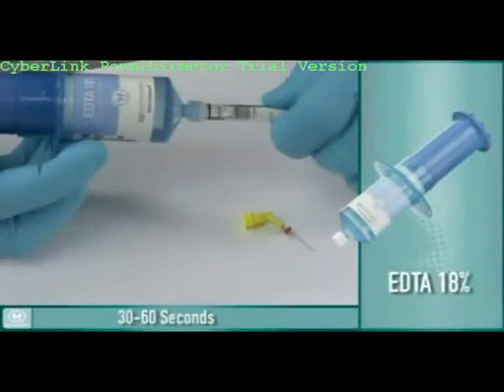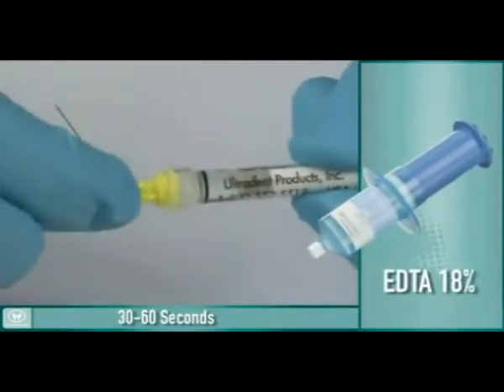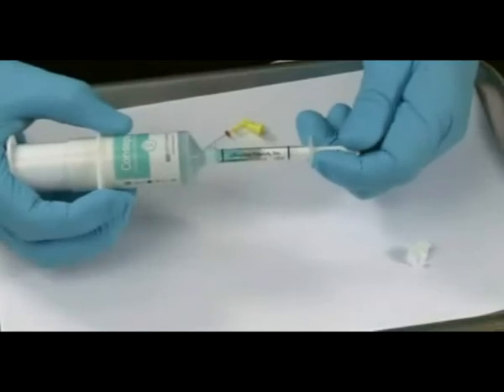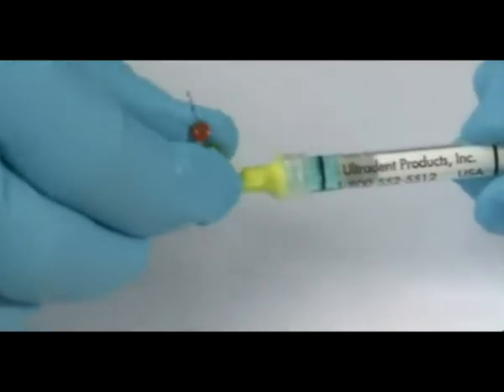Load a 1.2-milliliter syringe with liquid EDTA 18% from the Indispense syringe and attach a 30-gauge NaviTip. Next, load a 1.2-milliliter syringe with Consepsis, 2% chlorhexidine gluconate, and attach a 30-gauge NaviTip.